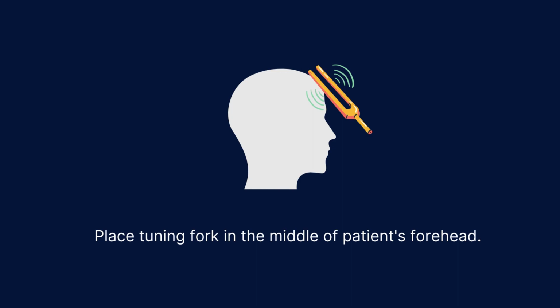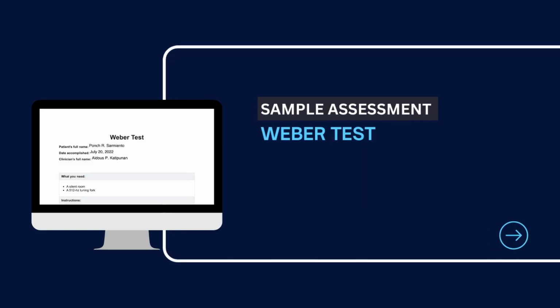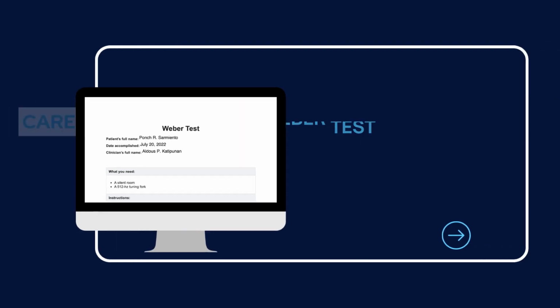Ask the patient if the sound is louder in the left, right, or middle. If the patient hears a sound right in the middle and the loudness is equal for both ears, that means their ears are fine. If the sound is louder in their affected ear, this is indicative of a unilateral conductive hearing loss. If the sound is louder in the unaffected ear or the better ear, this is indicative of sensorineural hearing loss. Here is a sample of our Weber test, which you can find on our Carepatron platform.